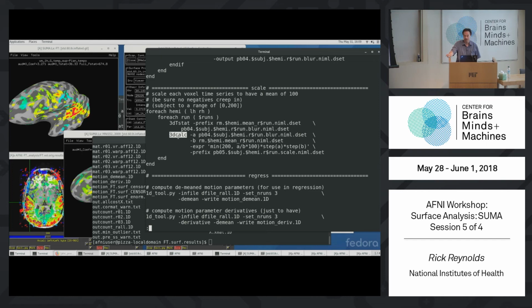What about clustering? Clustering is different. But performing the group analysis to get the t-stat at each location and the beta weight at each location, that's fine. So I think that's good for this part right here.